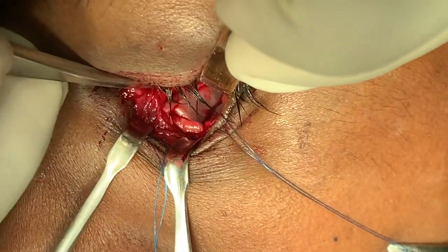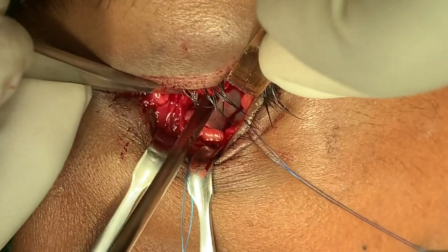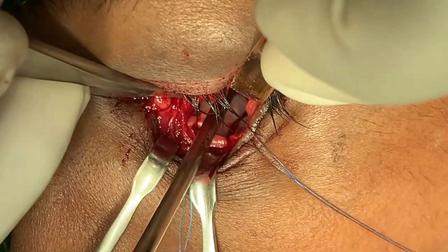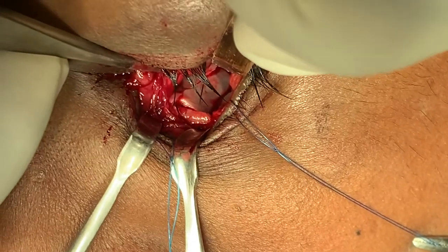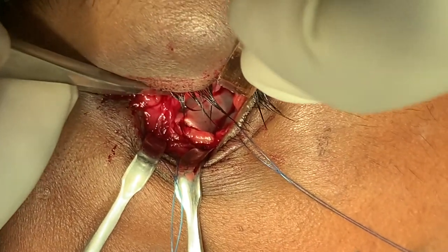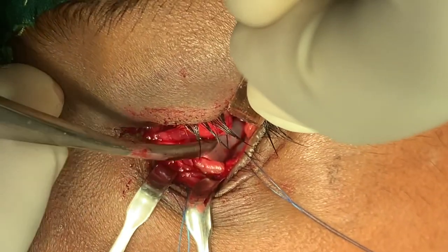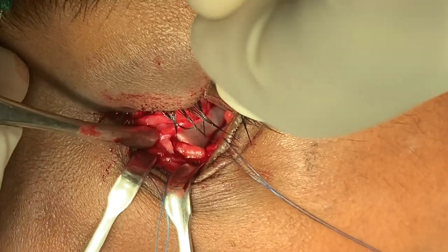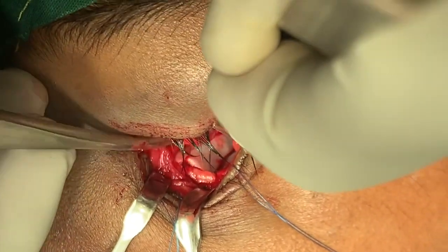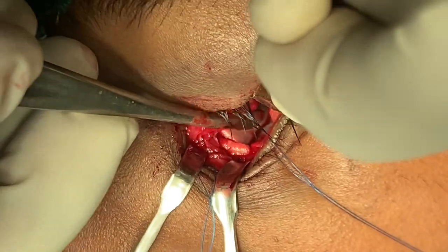Otherwise, the orbital volume reduces by way of herniation of fat and fibrosis, resulting eventually in enophthalmos, which is not so nice. This patient didn't have diplopia, didn't have any other issues, but I'm doing this because there was a 5 millimeter displacement on the scan. So now I'm going to put a nice mesh. The mesh is going to sit on stable bone. This is stable solid bone, stable solid bone.